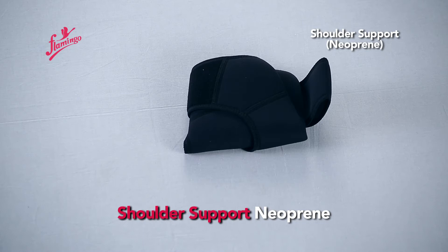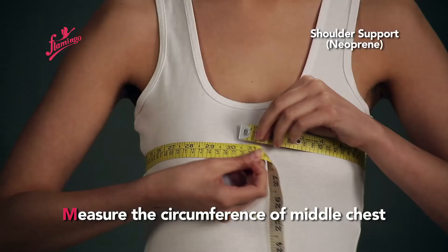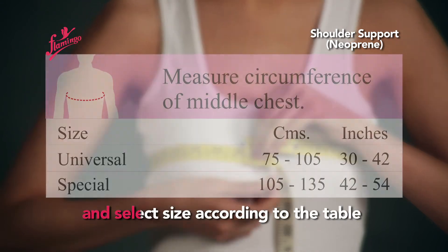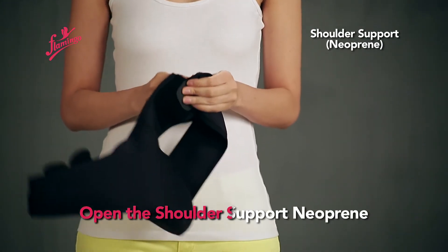Shoulder Support Neoprene. Measure the circumference of the middle chest and select size according to the table. Open the shoulder support neoprene.